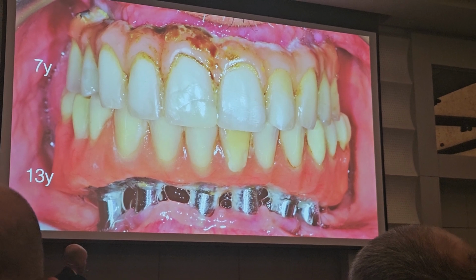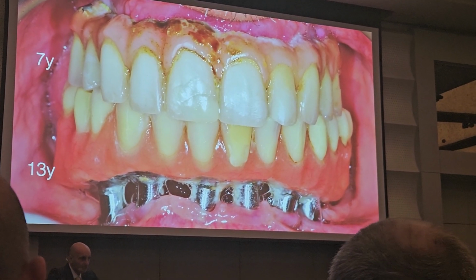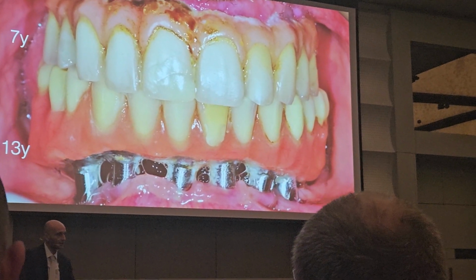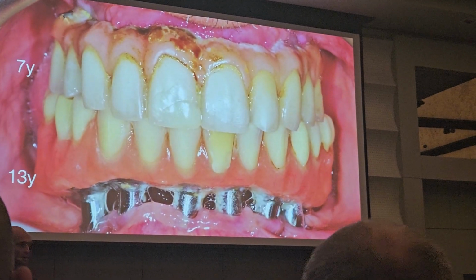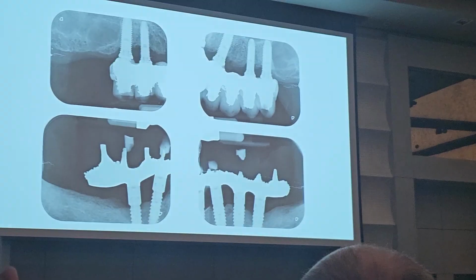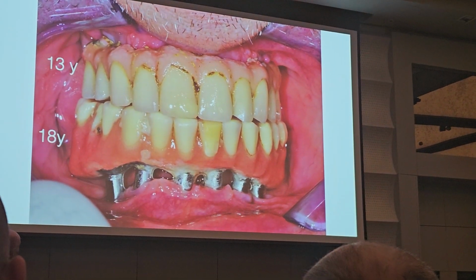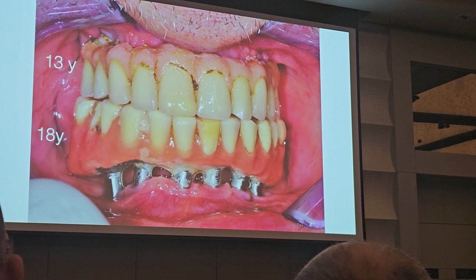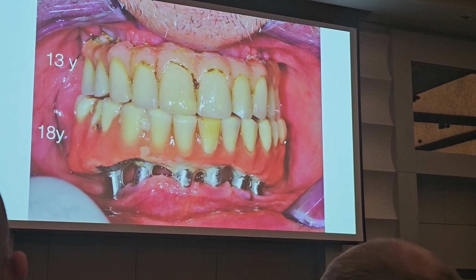On the lower arch, I did a suspended prosthesis because at the time in Sweden they were doing suspended prostheses. This is the acrylic. On the upper arch, instead, after 3-4 years, I did full arch cases with a metal framework and composite. And you can see, as time advanced, I did so many repairs. I did so many bad things. And this is the cosmetics. And you cannot imagine the smell of this patient.